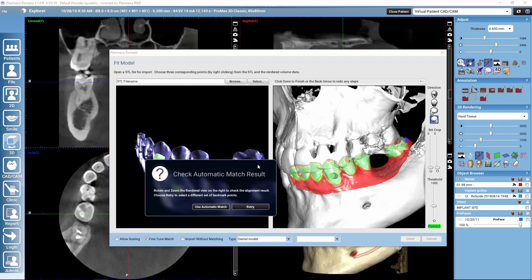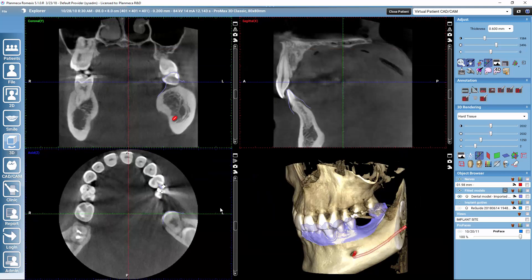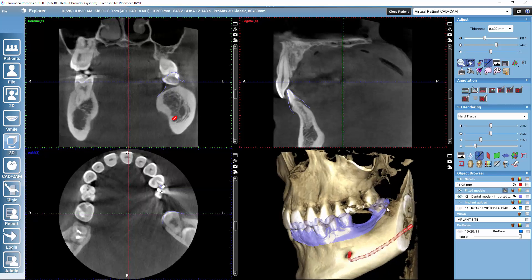If I'm happy with the three points I can select use automatic match. Normally speaking, giving three points is well enough for the matching. It is only in fully edentulous cases or in cases with a lot of artifacts that we might need to give more points. I always recommend trying first with three points, and normally you don't need to adjust the threshold for the CBCT. Just try with three points, make sure fine-tune match is checked, and then the automatic match should come out quite good. When I select use automatic match, Romexis shows the intraoral scan mapped to the CBCT.